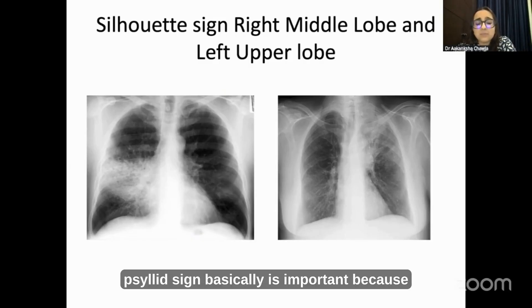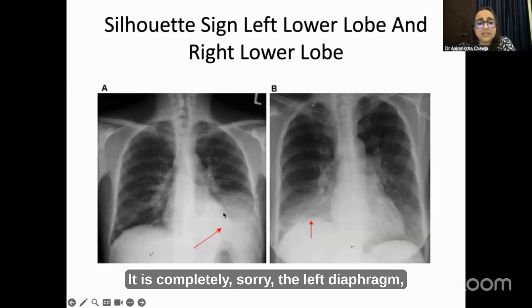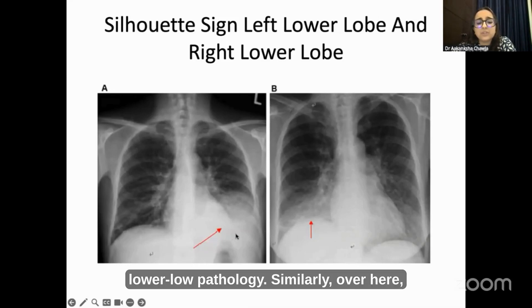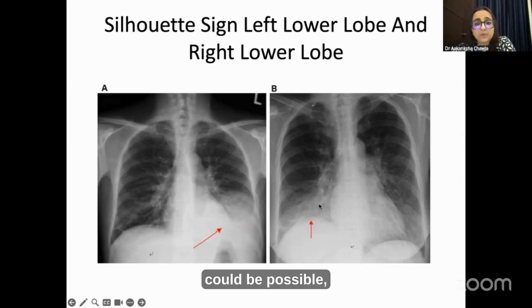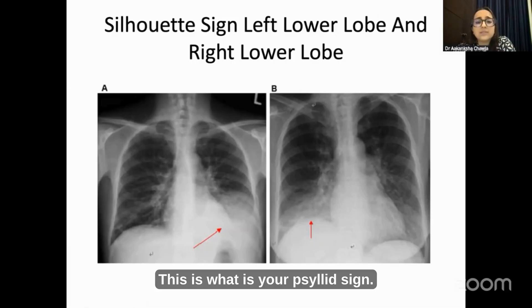The silhouette sign is important because it gives you anatomical cues. Look at the left diaphragm — if it is completely gone, this is a left lower lobe pathology. Similarly, an obscuration on the right diaphragmatic shadow indicates possible right lower lobe pathology. This is the silhouette sign.